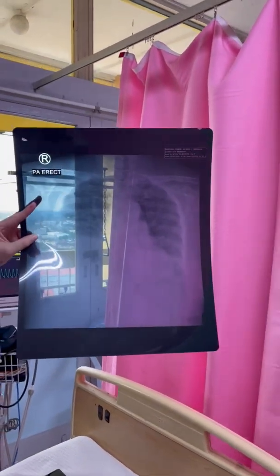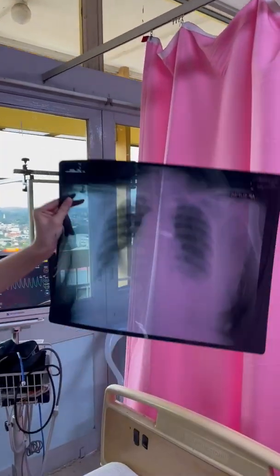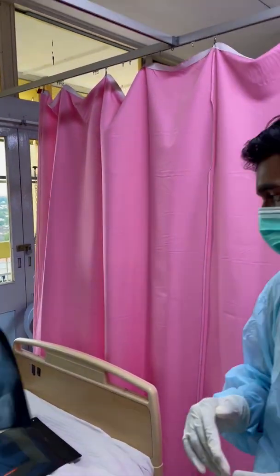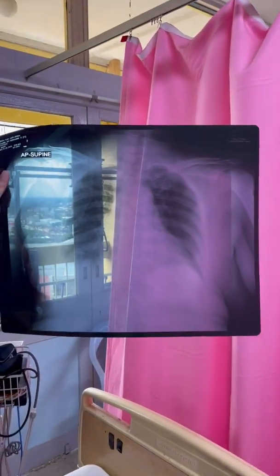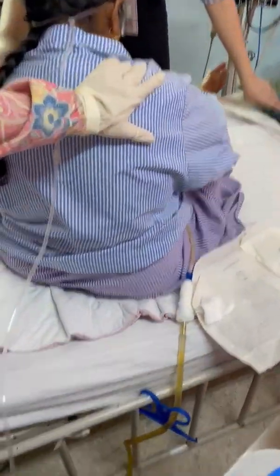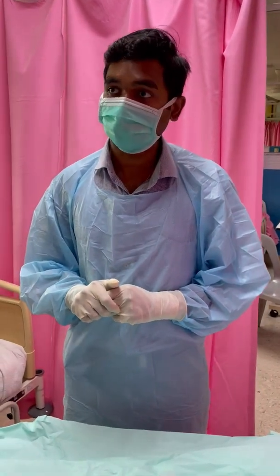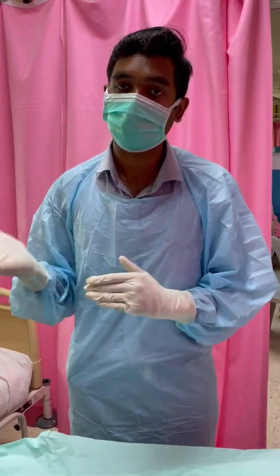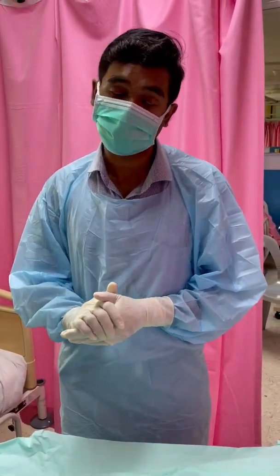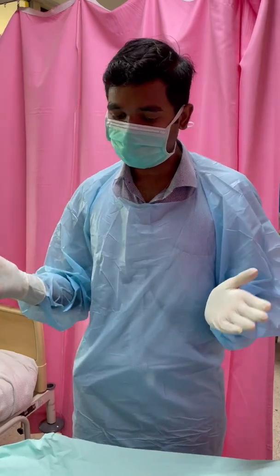This is the first X-ray when she first came in, followed by the latest X-ray taken today, showing lung re-expansion. Over the right side, you can see the lung re-expansion. We must also ensure the pleural drain is functioning. There is another checklist we can follow, but it turned out to be less relevant in later studies, which is that the drain fluid should be less than 150 in 24 hours. Once all the checklists are fulfilled, we show our preparation list.